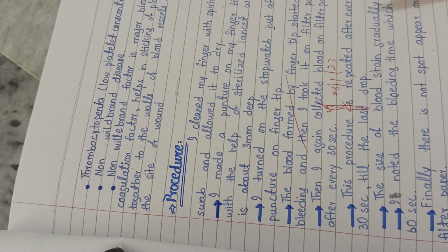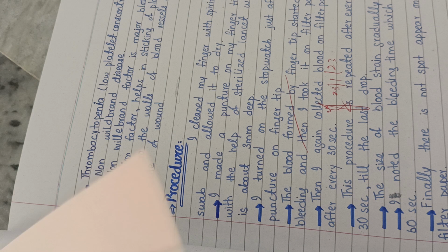So the first drop appears after 30 seconds, then another drop appears after 30 more seconds. So 30 plus 30 gives you 60 seconds. It means your bleeding time is 60 seconds, which is normal. So in that case you will find out your bleeding time.